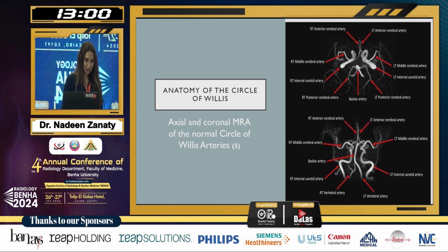We have the axial and coronal MRA, as you can see here on the screen now. As you can see here, the basilar artery, and where it comes from, the two vertebral arteries into the posterior circulation, and then we have the two internal carotid arteries with, laterally, the two middle cerebral arteries, the anterior cerebral and the ACOM.